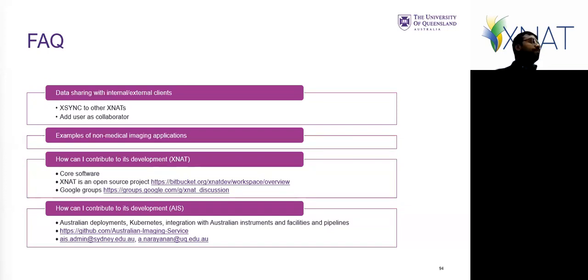I think for the big projects that we've got, there's usually one source, I guess. Yeah. And then lots of sites that we send into the source. Yeah. So I might just repeat it into the mic. So can you send Xsync to multiple projects? What you can't do is one to many, which is one project going to many different projects. But the Xsync configuration is only on the source project. So you can get one project to send to another, and that one can send to another one from there.